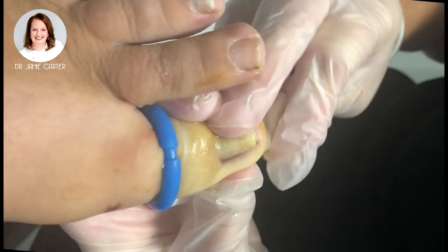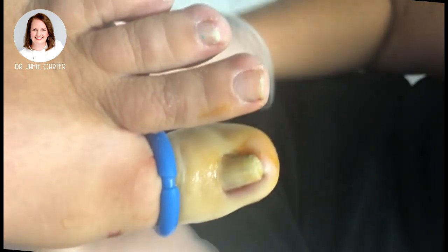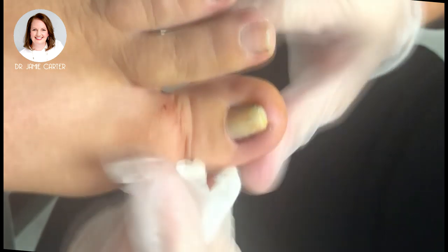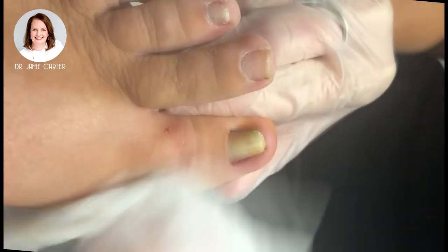Hopefully the skin will fold right over and we won't have to do this anymore. Once the procedure is complete we remove the tourniquet and the color will return to normal minus a little bit of betadine, and you'll see that it starts to bleed.